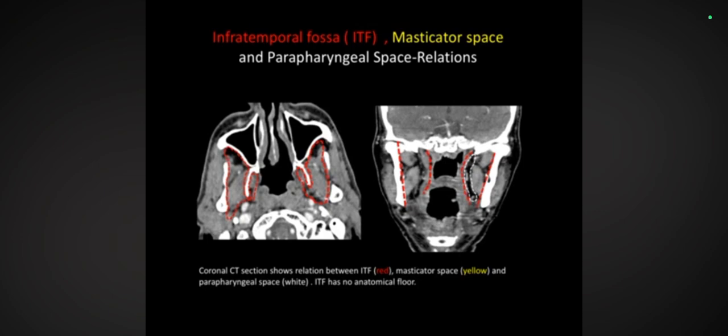How should we get reported? Like if it's high ITF involvement, the coronoid process is the only thing. I knew it was coming. Yeah. So remember the coronoid process.